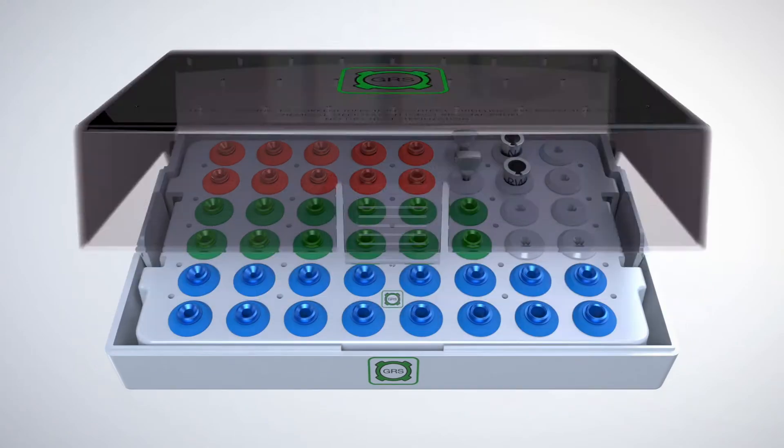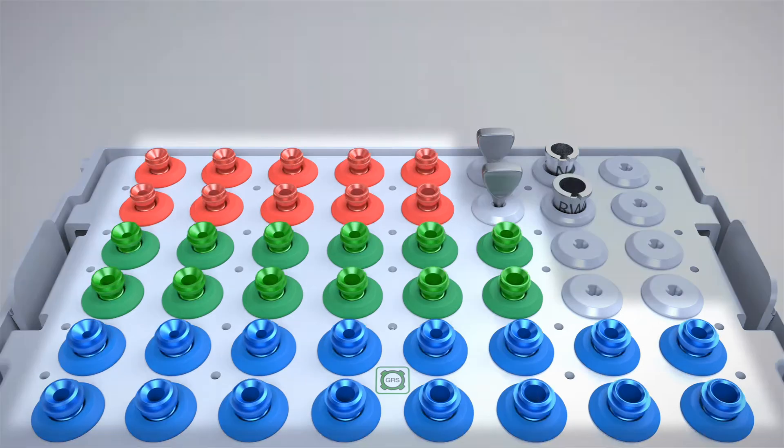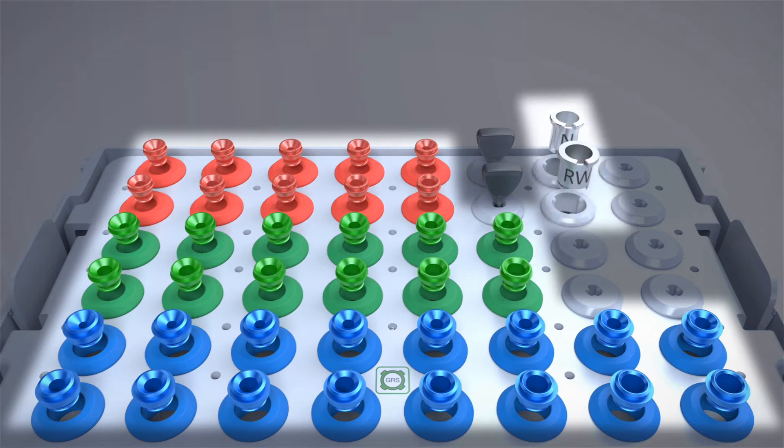The GRS Surgical Cassette conveniently secures all GRS components required for guided dental implant surgery. GRS Surgical Drill Sleeves are color-coded and numbered for easy identification. GRS IR tools are used to conveniently insert and remove all drill sleeves from the surgical cassette and surgical guides.